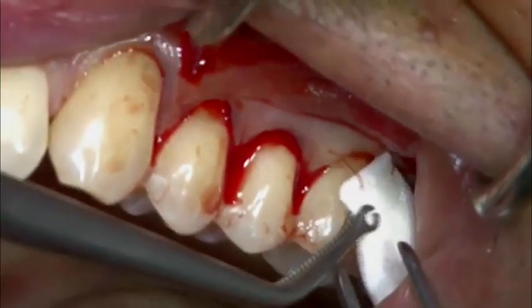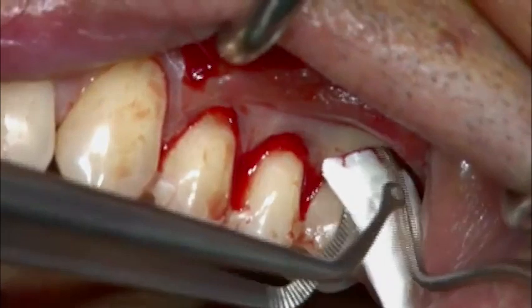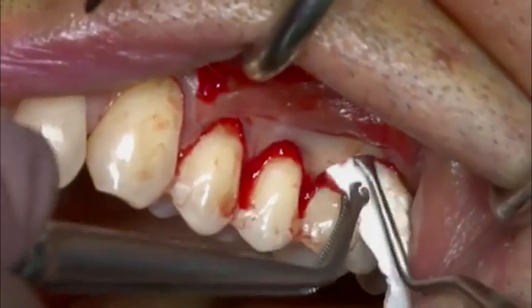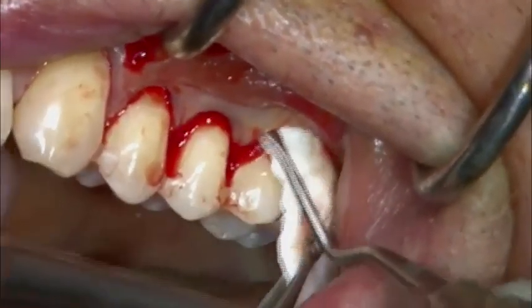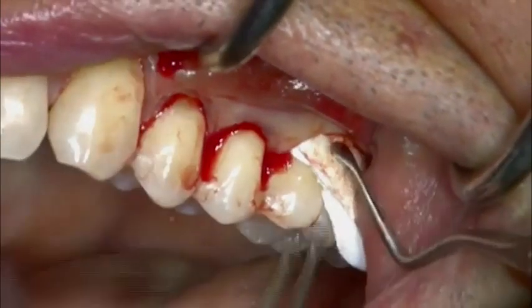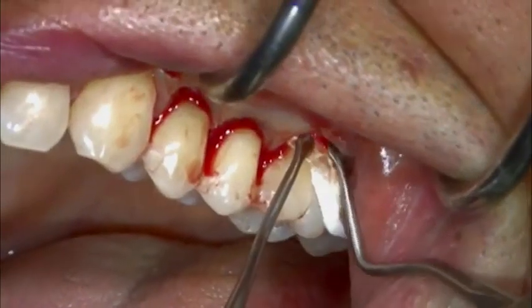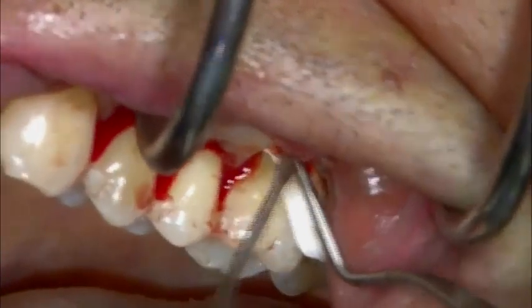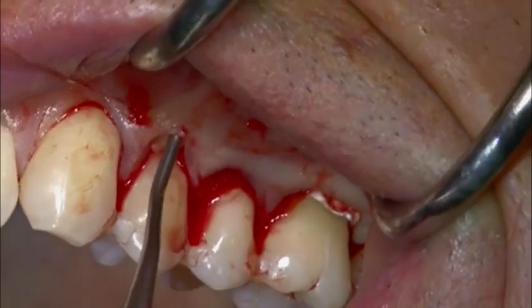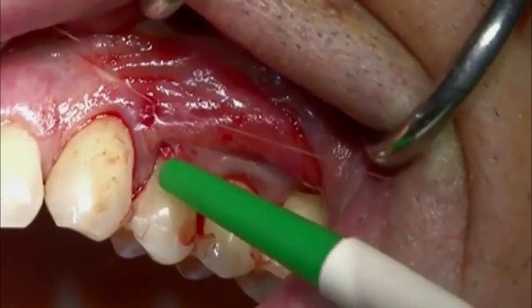The dry Geistlich Mucograft is inserted into the tunnel with a slightly oblique angle and then gently pulled laterally through the tunnel. The matrix moistens rapidly with the patient's own blood as a result of its marked hydrophilicity. Geistlich Mucograft is then fixed to the elevated flap.